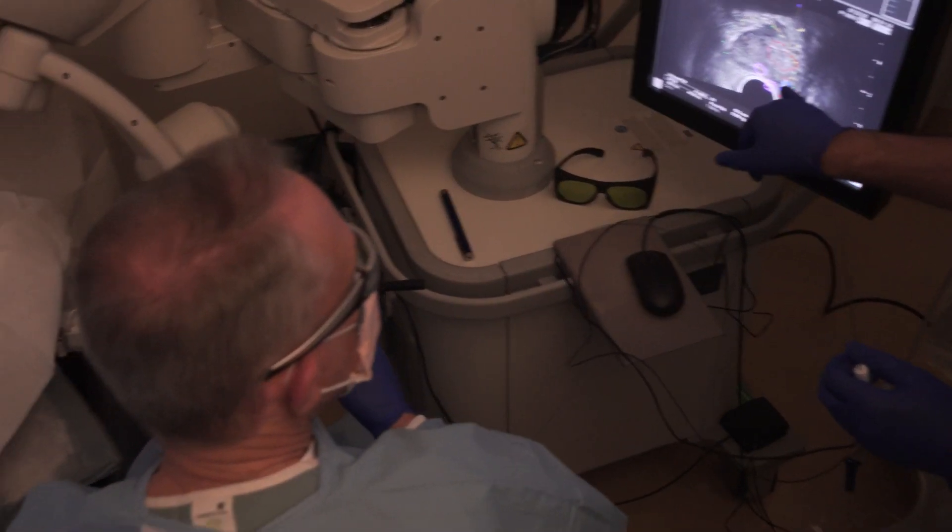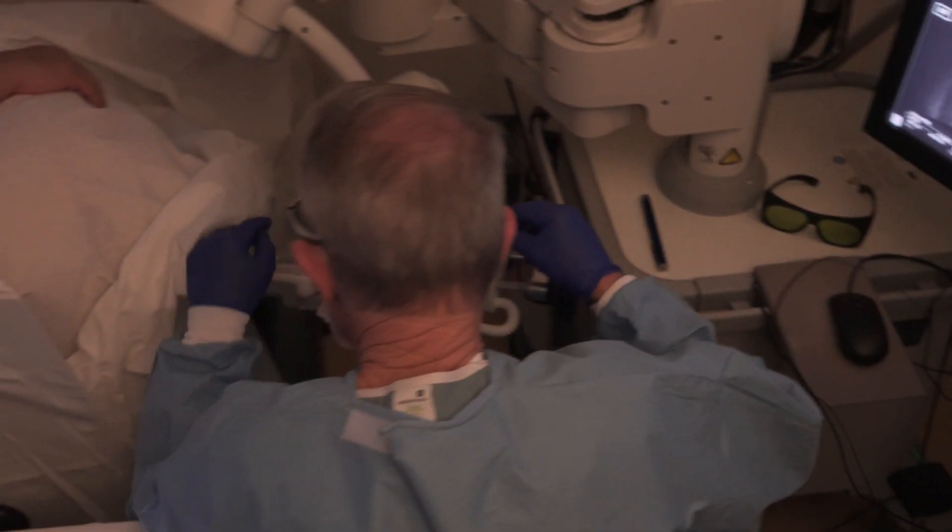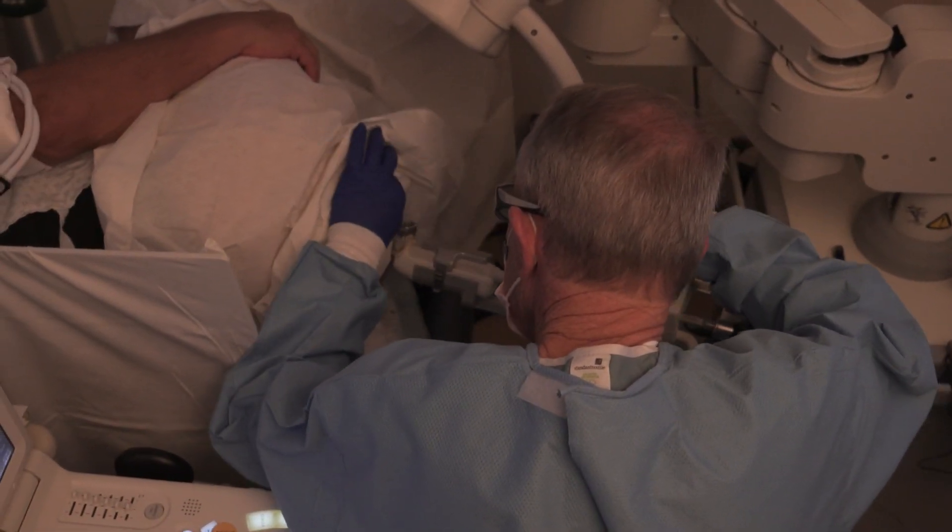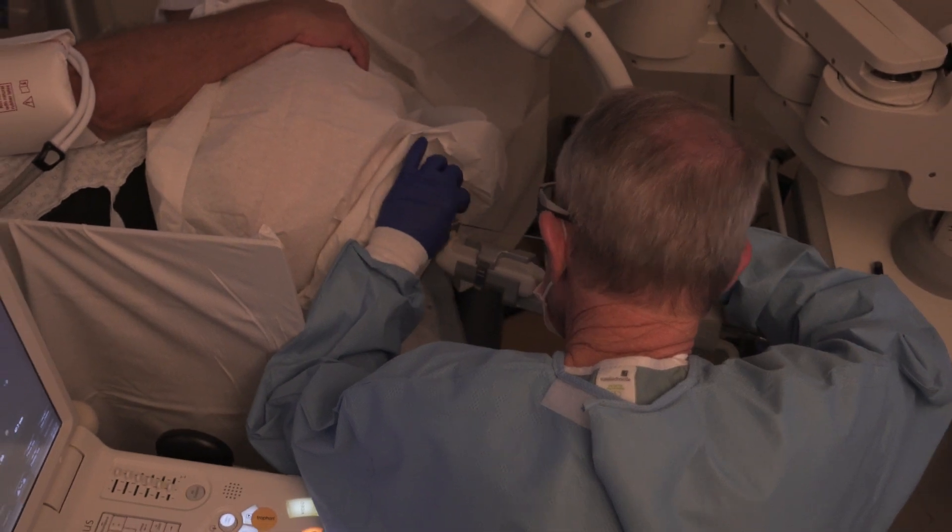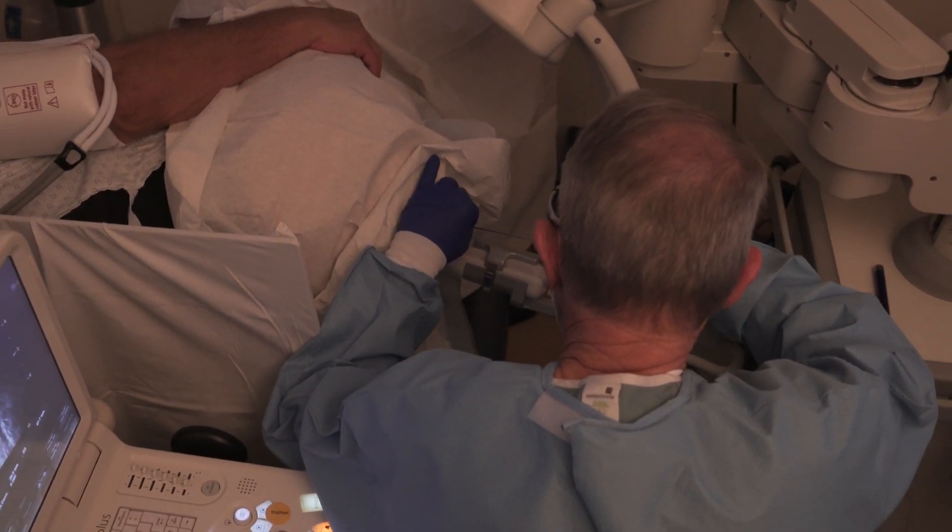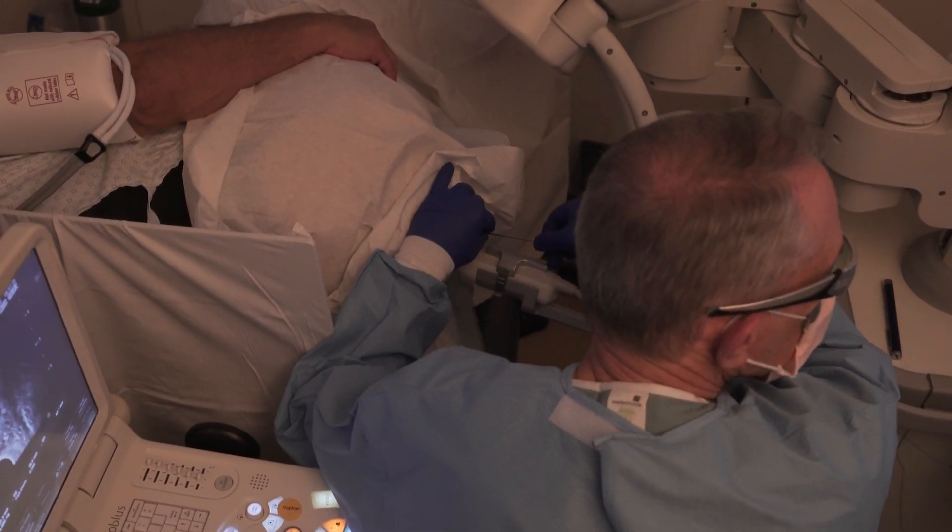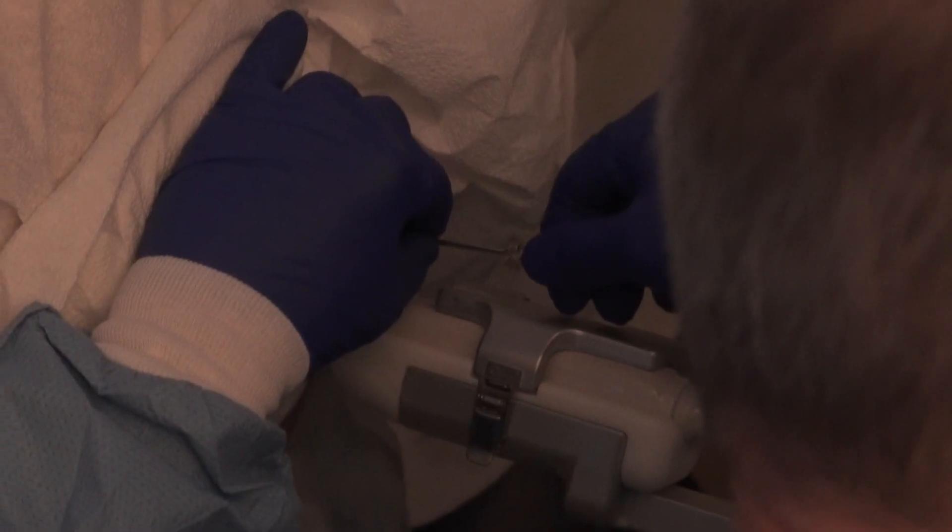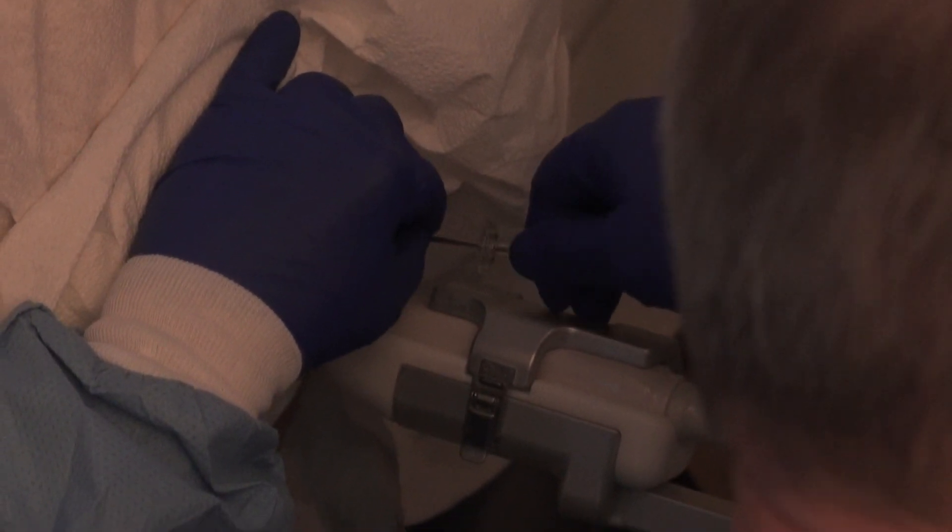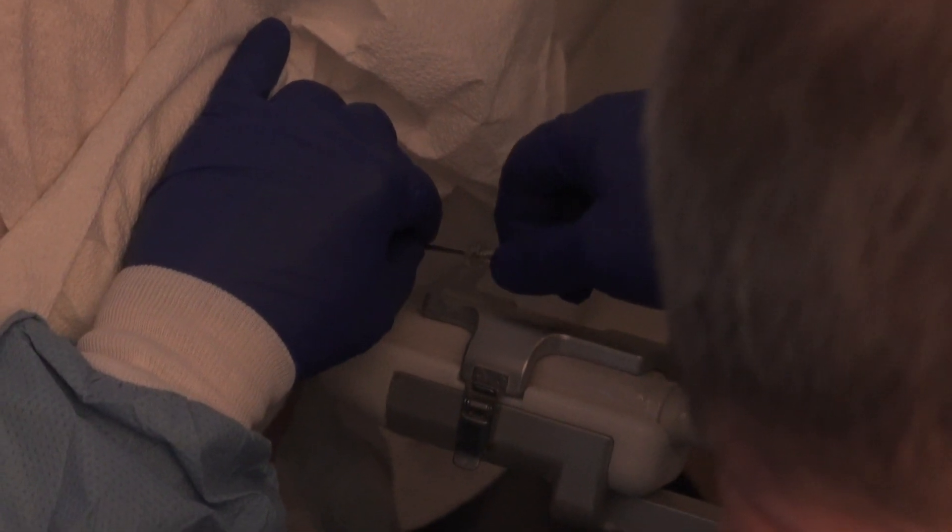Once at the desired ablation site, the 14-gauge laser catheter is inserted into the center channel of the guide. Note that the guide is curved to provide gentle friction and prevent treatment elements from slipping backward during ablation.